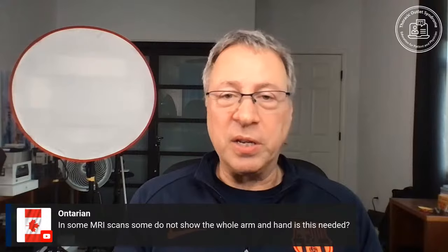So we don't include the entire head or the entire chest. We try to limit the area we view just to the region of interest, the cervical spine, the thoracic outlet, and just getting into the shoulder. I hope that answers your question.